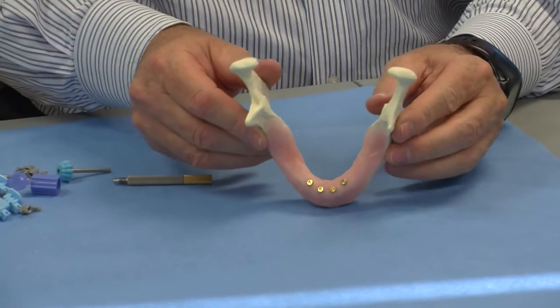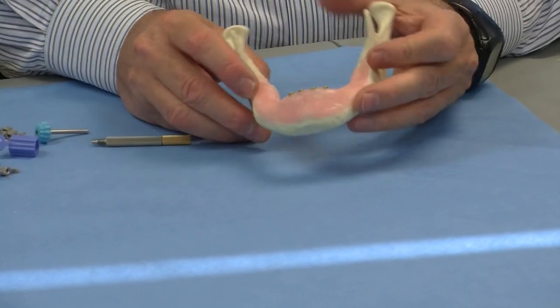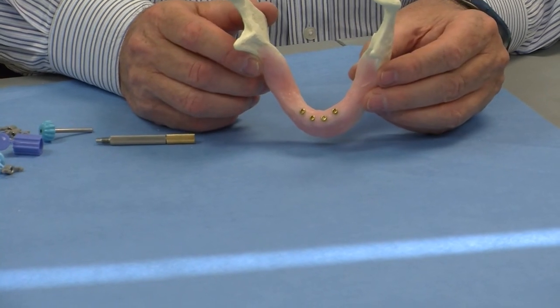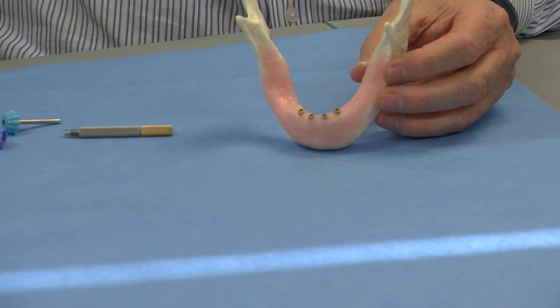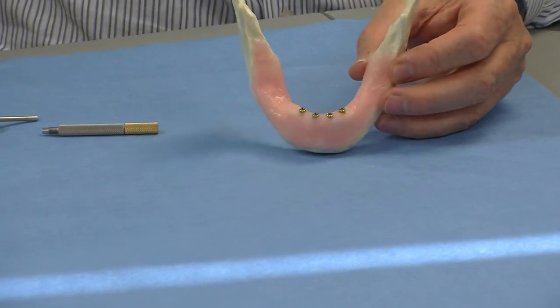Here is the installation of 4 locator attachments, which are strictly parallel with each other, using the Cyber Implant surgical guide.